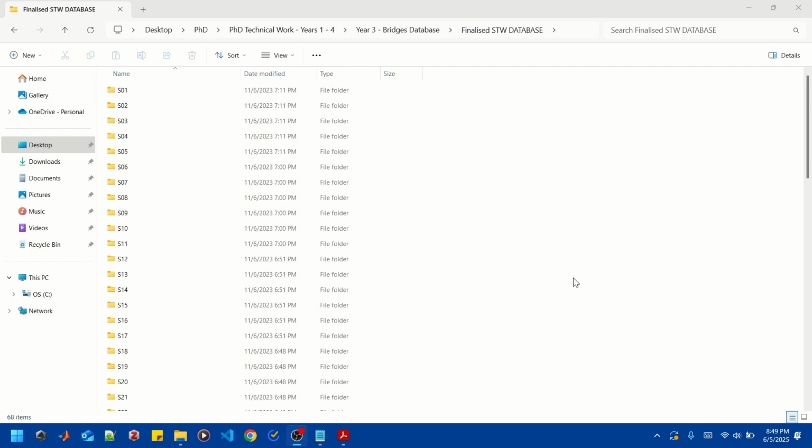Right, and that brings us to number 17, which is to do with data storage and labeling. So after every trial, make sure you store your data properly, make sure you back your data up because it's very easy to make a mistake and lose your data. When storing your data, you should store it in a de-identified manner and be methodical and organized in how you store it. So for example, use a consistent naming convention when you store and label and name your files.